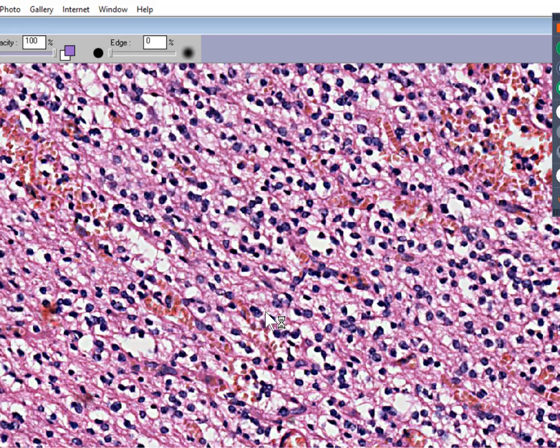Because the halo is fatty tissue, and myelin is fatty tissue. So, what type of brain glial cell is very highly myelinated? You're right. It's the myelination cells of the central nervous system, the oligodendrocytes. So what does that mean? It means this is an oligodendroglioma. And now you know why it's called that.